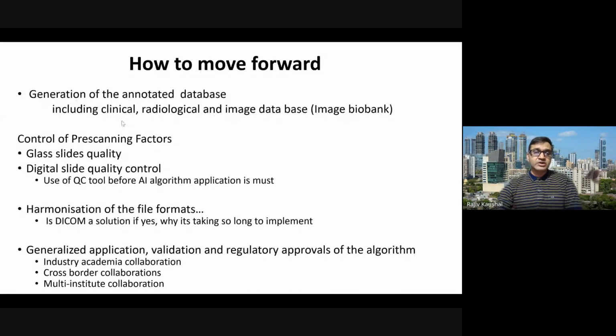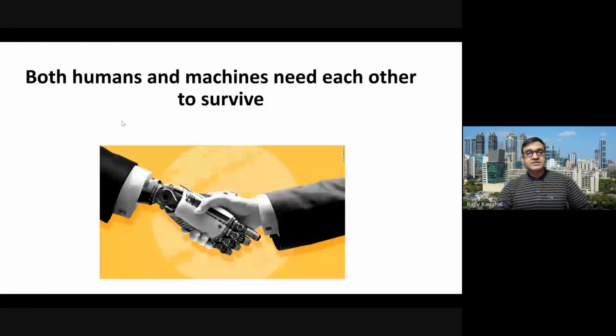There is a need to keep control on the pre-scanning factors. So even if you are not using any of the models right now, develop a good image database, so that whenever in future you want to use any of these applications for clinical practice, you are ready with a good quality image data set. So both humans and machines, we need each other to survive.